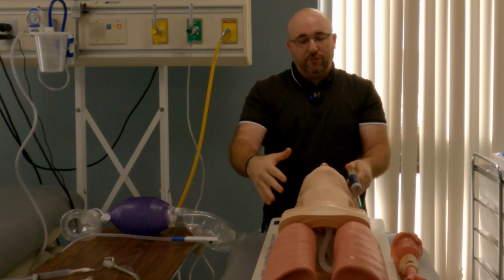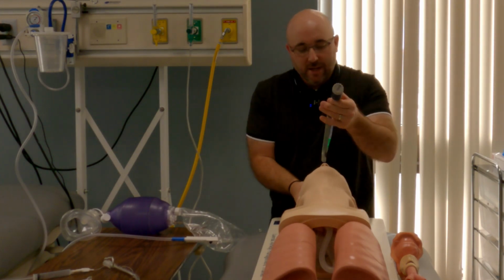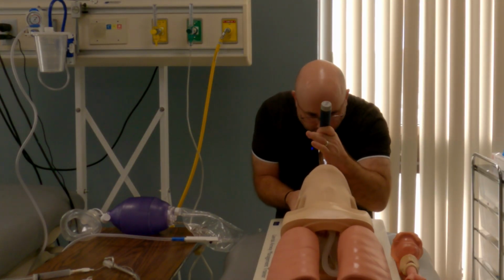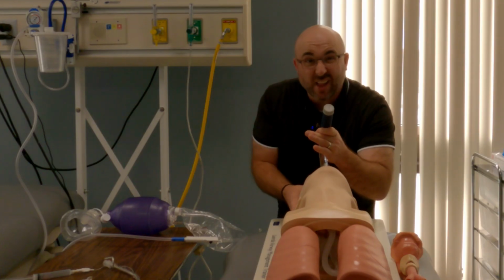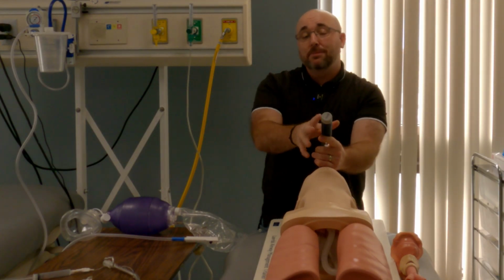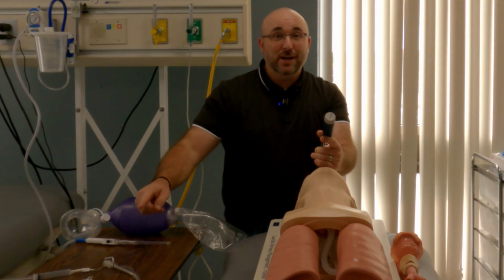The endotracheal tube always comes from the patient's right side, which is why you're placed on the right side. So they're going to go in and look. When they go in to look for intubation, they're going to be trying to visualize the vocal cords. There are 2 different things that the person intubating may ask for. They may ask for suction, and they may ask for the endotracheal tube.